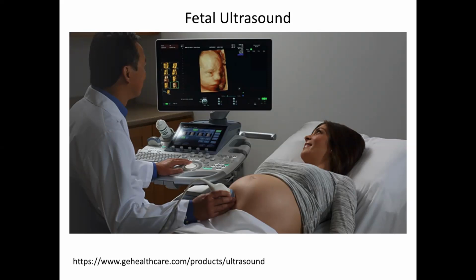So you can make ridiculously good 3D pictures when the object isn't moving too fast, right? So in OBGYN, when you're looking at babies, you can make these fantastic pictures because when they move, they get very distorted, a very distorted, scary look about them. Like, what is that? But when they're stationary, they look great. And so you get innumerable, really cute early pictures of your baby.